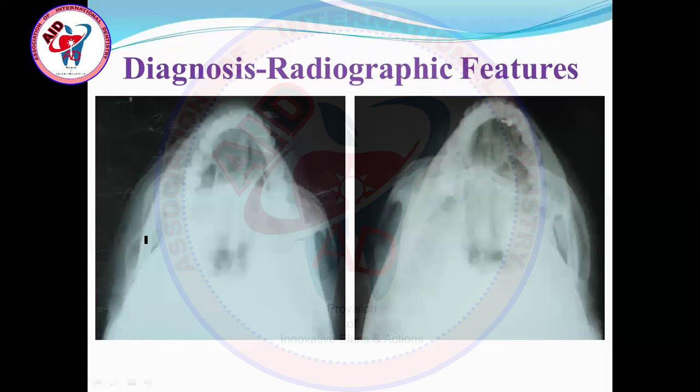And this is the post-op radiograph of the same patient. This arch was just elevated with the Gillies approach. That is one of the treatment options, a conservative option for zygomatic arch management. And this is the post-op radiograph. Now the arch is in its normal location. Here is a slight fracture which will get remodeled in future and will heal properly. And this is the whole management point.